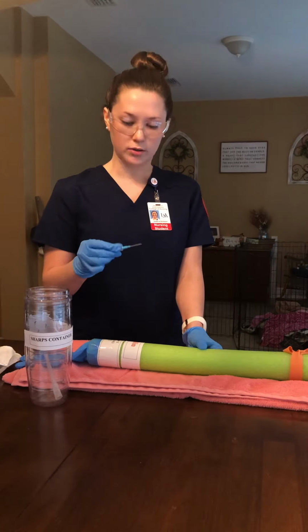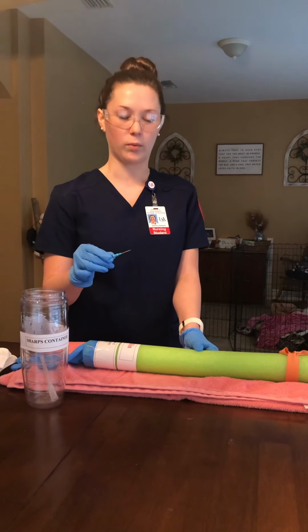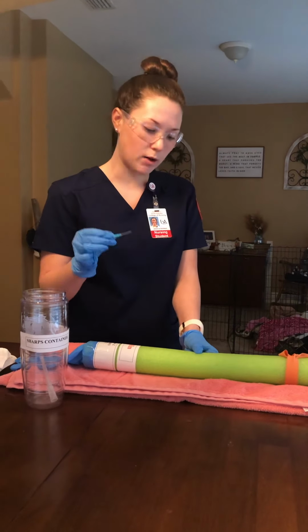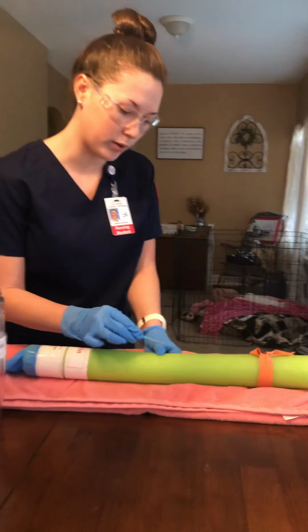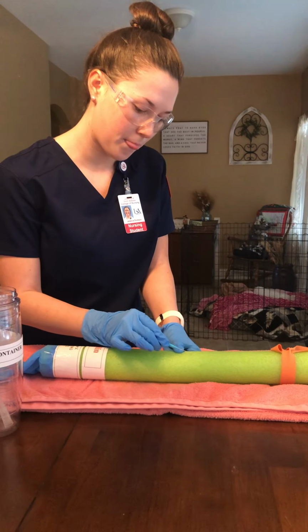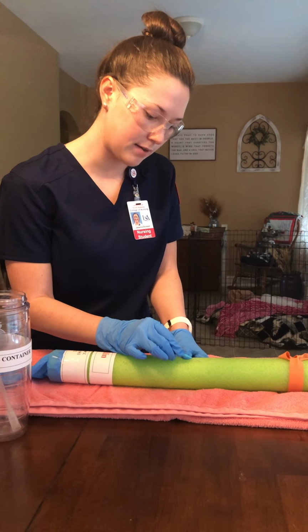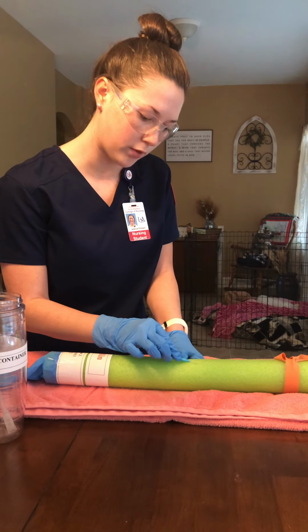So also I'm going to want to instruct my patient to remain still and that there will be a quick poke. So now before insertion, I want to make sure that the bevel is up. Once the bevel is up, I'm going to insert at a 10 to 30 degree angle, making sure that I avoid touching my gloved hand to the catheter. So once I get it in there, I see blood return. I'm going to lower it, and then I'm going to insert 1/4 of an inch more.